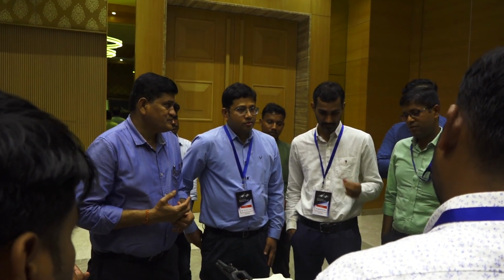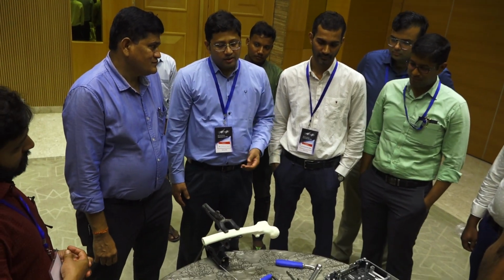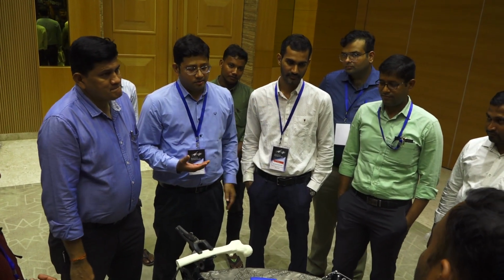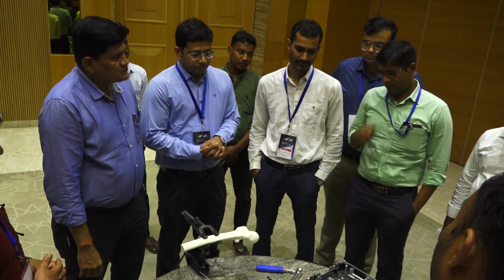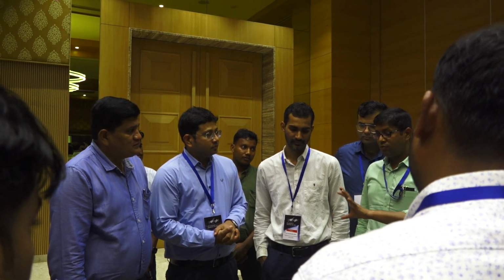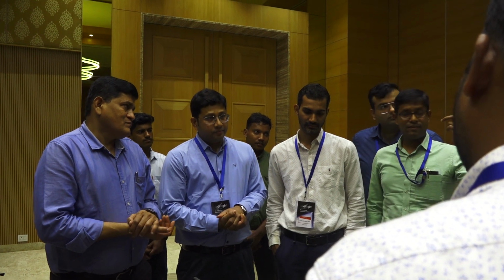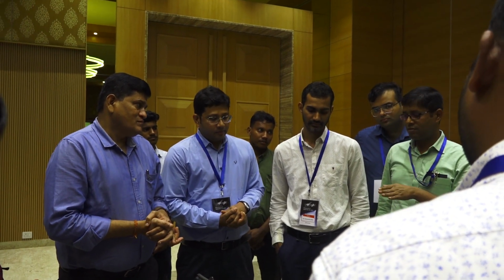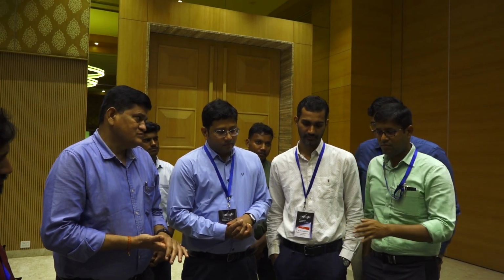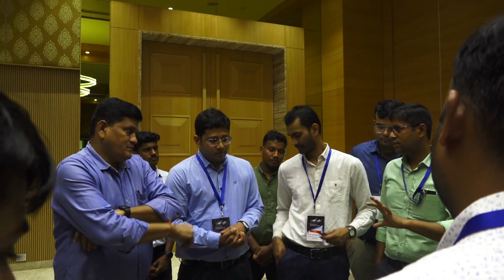Yes. On the fracture table. So after anesthesia, we put it on a fracture table. So how do you position the limbs, both limbs in traction or the other limb in 90-90 flexion? Okay. Then after traction, you will see how many parts are there, and how is the orientation. Yes. Like Professor showed us how he used to reduce it. If it is a simple fracture, then it may come to a reduction with the traction and somewhat internal rotation or external rotation can align.